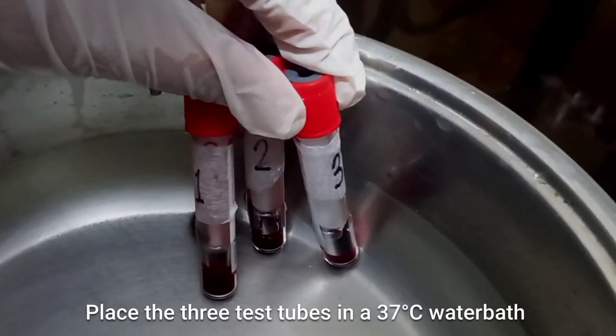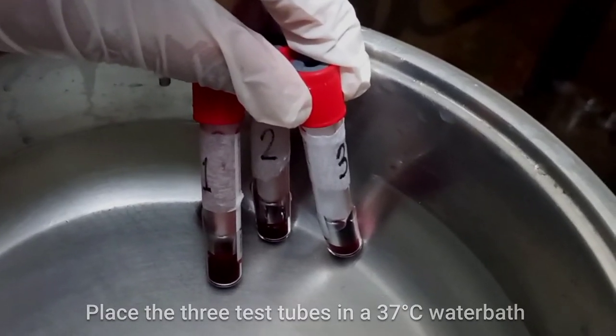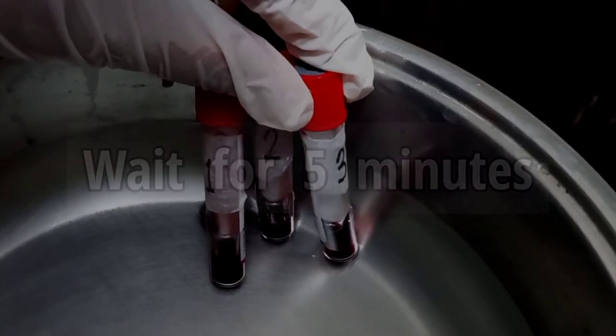Place the 3 test tubes in a 37 degree Celsius water bath and we will wait for 5 minutes.